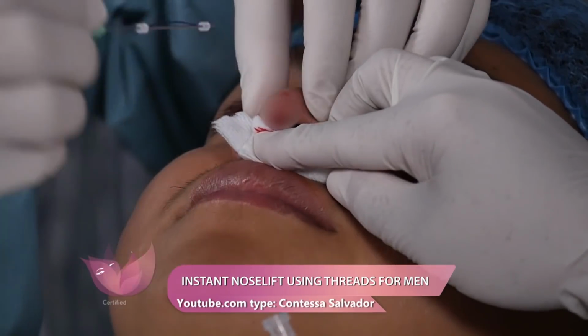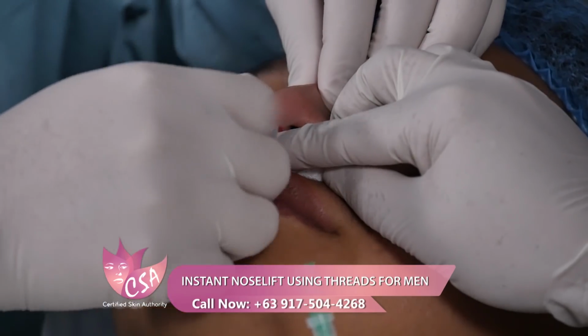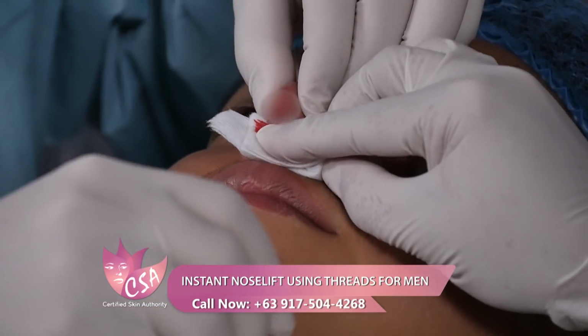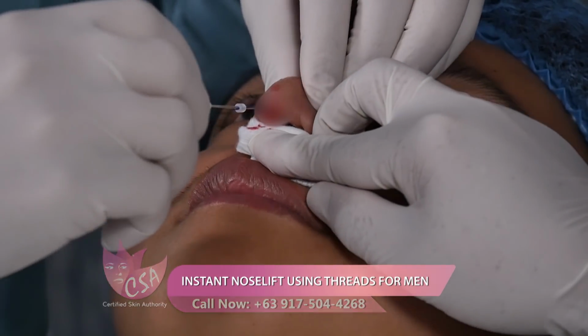Okay, and then our third one. So this is inserting this Wyco PDO polydioxanone into the nasal bridge. So this is my fourth PDO thread.